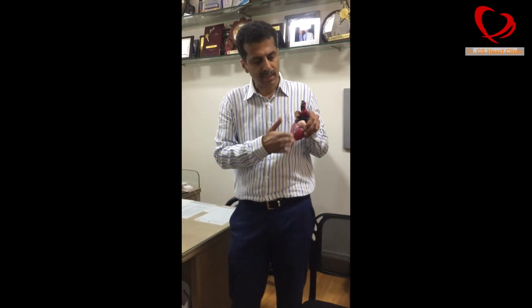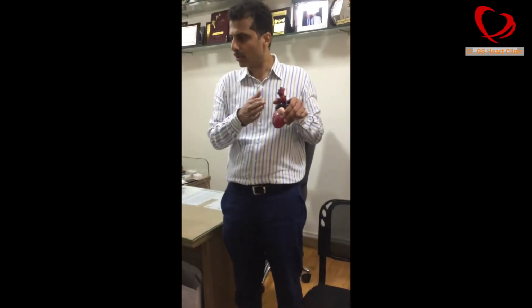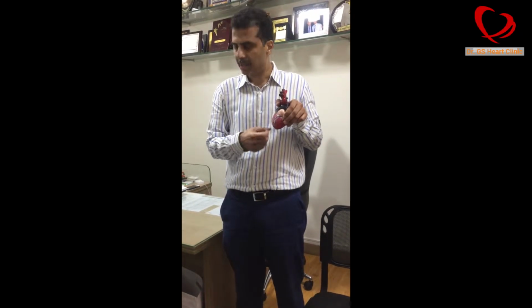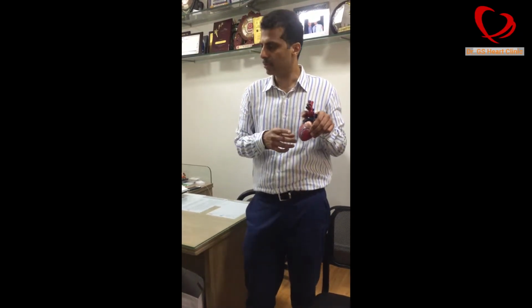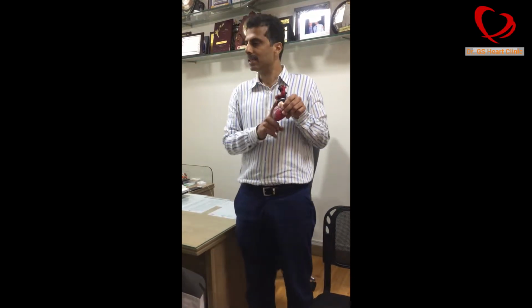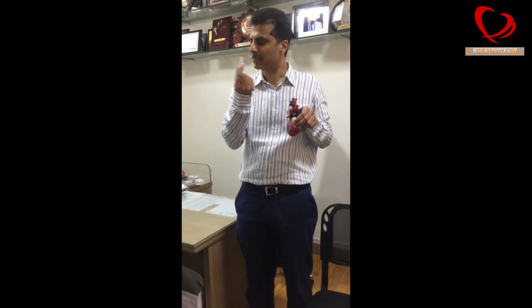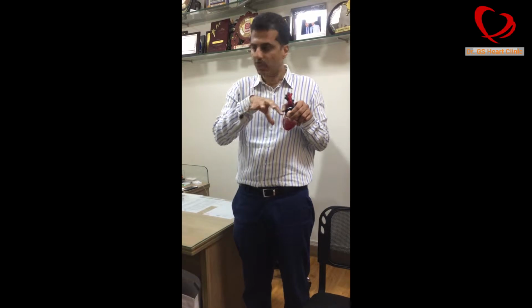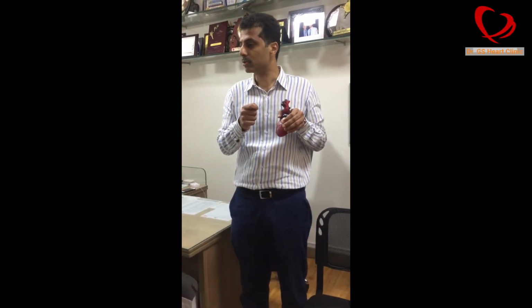So what we have done is another advanced imaging, which is OCT. OCT is optical coherence tomography, where with one injection of dye, we can get a complete three-dimensional view of the artery. We send a small something like a camera which emits infrared light, and with the light we can see the blood vessel, with a magnification almost like an electron microscope. It is such high magnification.